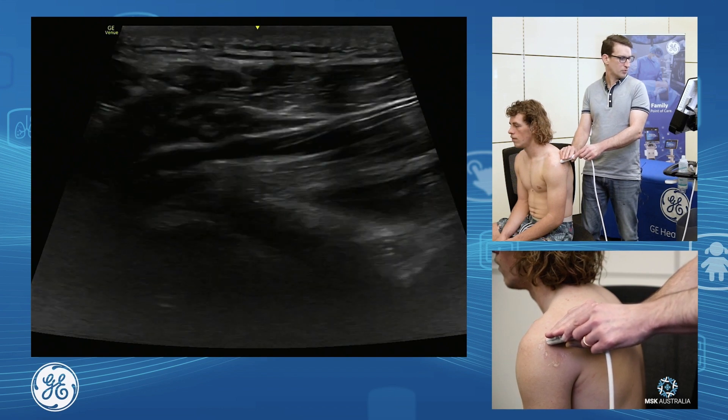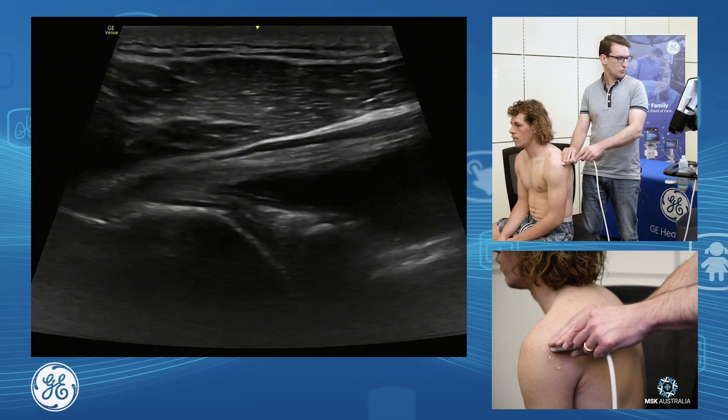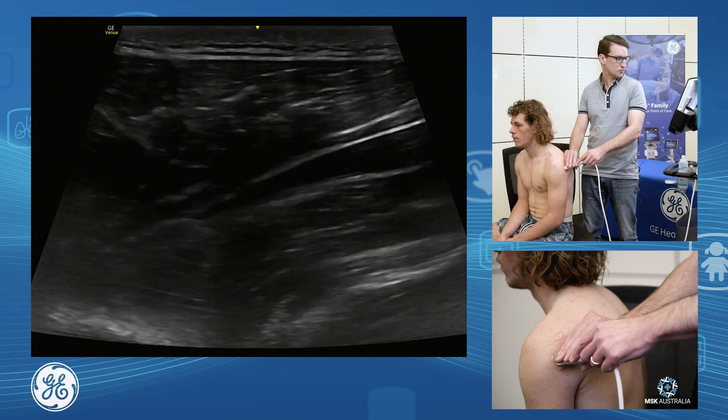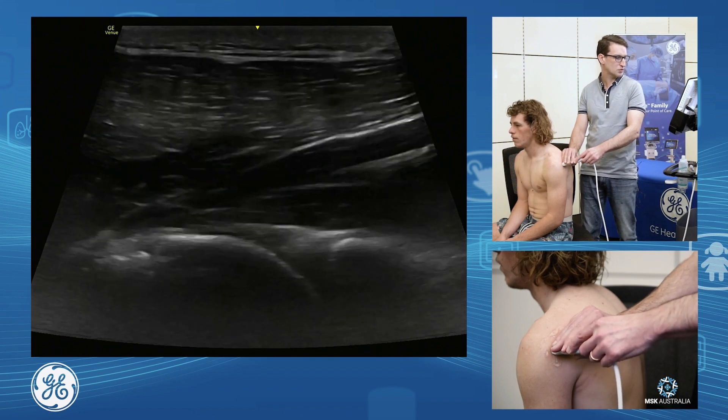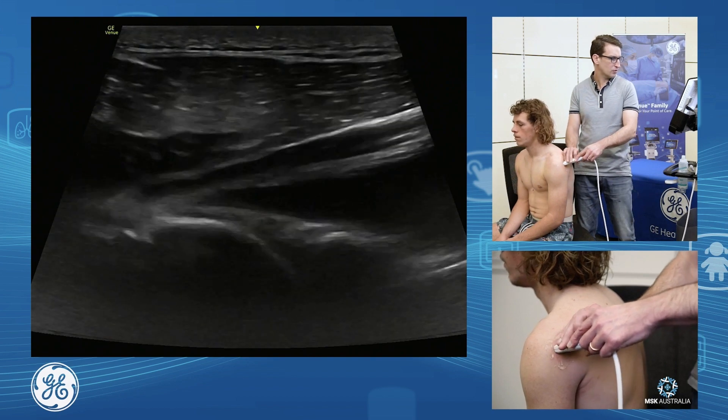So I'm going to fan up as far as I can, and then just slide my probe down all the way through to the inferior joint capsule and beyond, just to make sure there are no labral cysts off the bottom. So we can see we've assessed the whole way through.